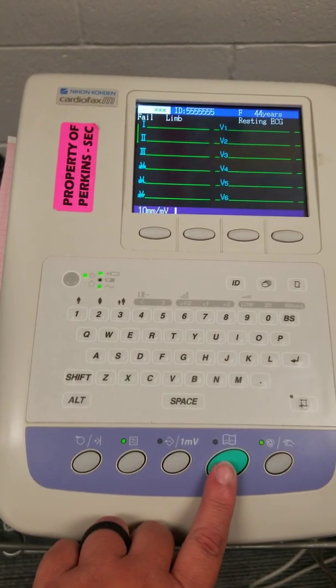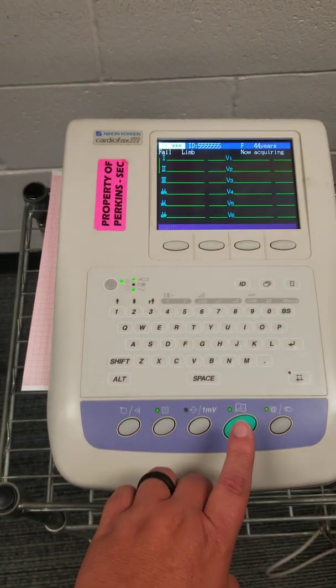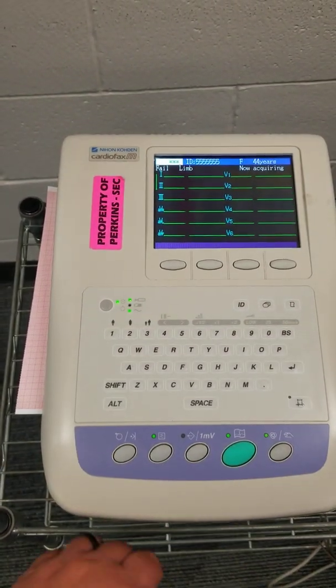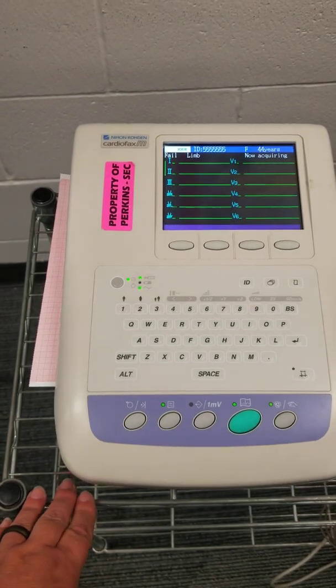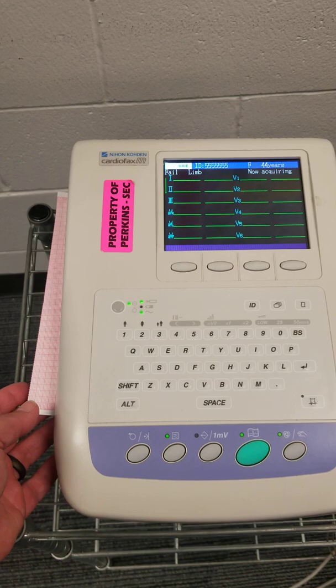The green button is my print button. I'm going to click it, and I will see where it says 'now acquiring.' Once it's done acquiring and it has read what it needs to, it will begin to print out.